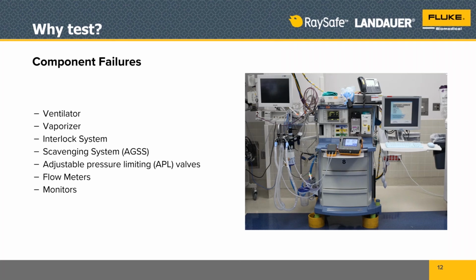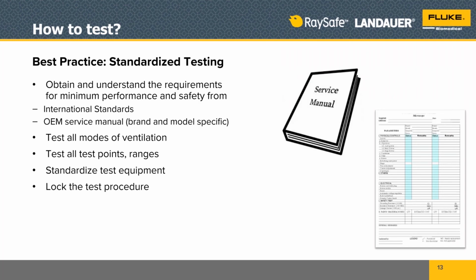Okay, so how do we test? So we talked about why, all the different things that can happen. Now we'll talk about how. And we're going to talk about what we believe the best practices should be. The first one is about standardized testing.